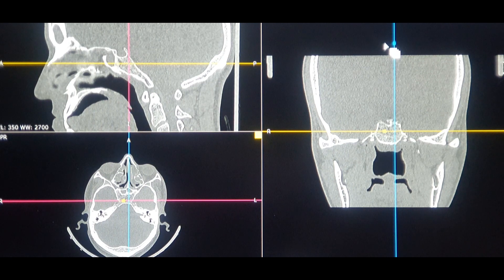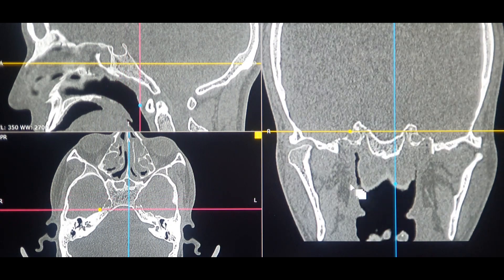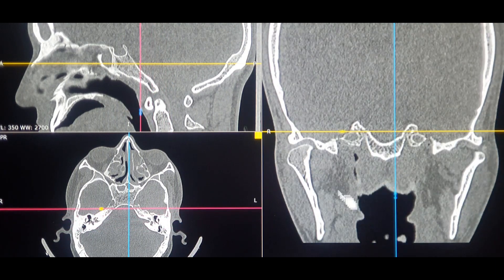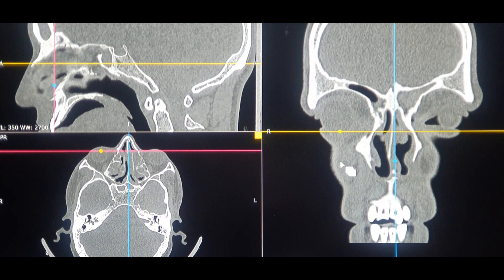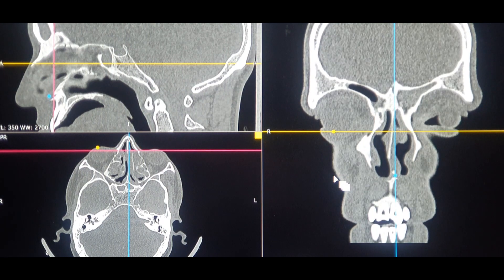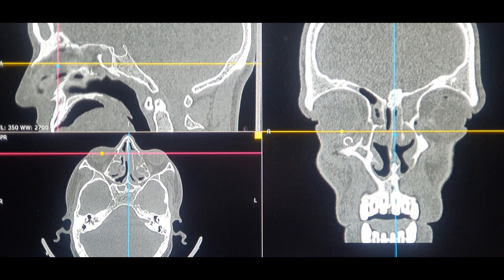Now I'll show a zoomed-out version covering all three. First, we need to locate the lacrimal fossa on the coronal section. I'll go to the most anterior aspect of the patient's CT scan toward the frontal skin. As I explained in my last lecture, to identify the lacrimal fossa area you follow the frontal nasal process of the maxilla. As you can see, this is the frontal nasal process of maxilla. Going behind slowly, you start seeing the first pneumatized air cell — the agger nasi cell — and a depression lateral to the frontal nasal process, which is the lacrimal fossa.